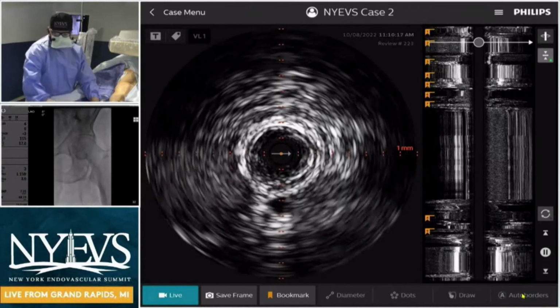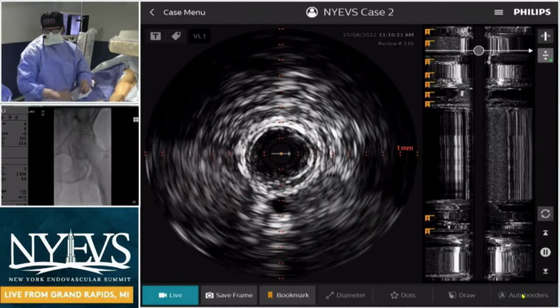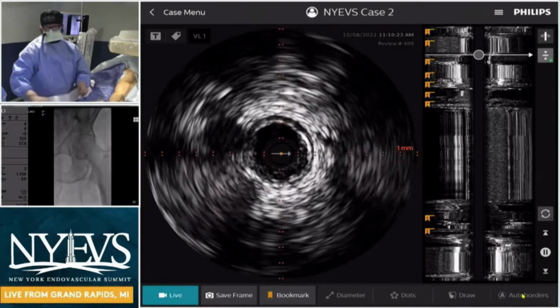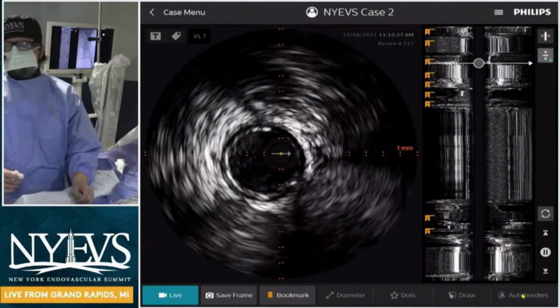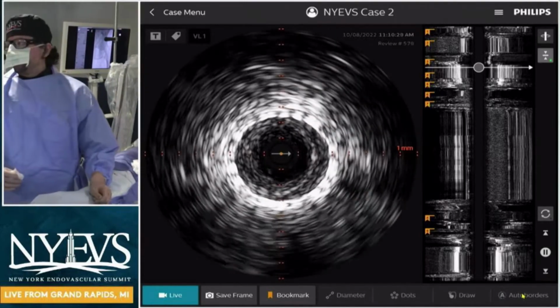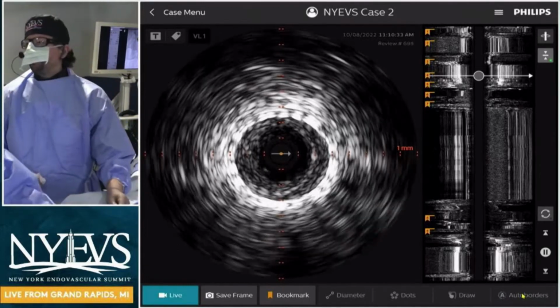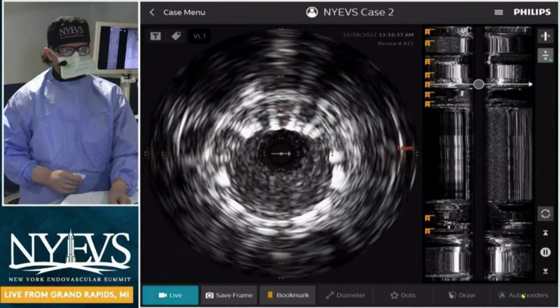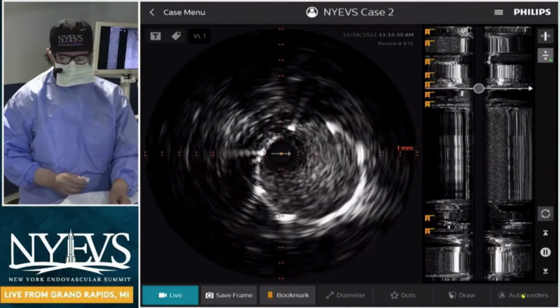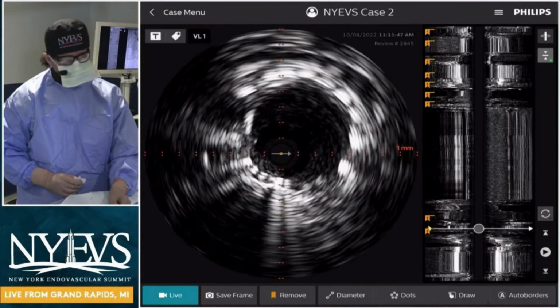Karthik, so you've got three choices from Shadi. Karthik? I would probably choose the same. I would either go with laser or Rotarex, and of course DCB. Looks like it's all just neointimal. Really, I don't see any calcification. Thrombus, I think, is questionable. I think there is some component of thrombus always in some in-stent restenosis, so it is definitely involved, but definitely mostly restenotic tissue.